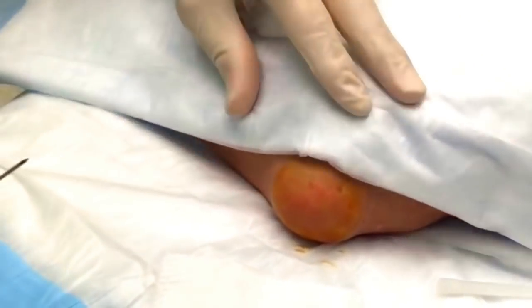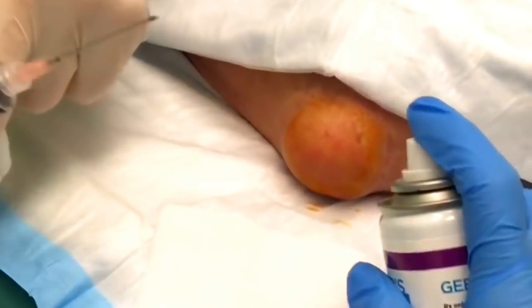Okay, so we're going to see if we can get Gonzo to spray some cold spray. And what we're going to do is, you're not going to look because we're going to stick a needle in there. We're going to try to draw that fluid out for you, okay? All right.